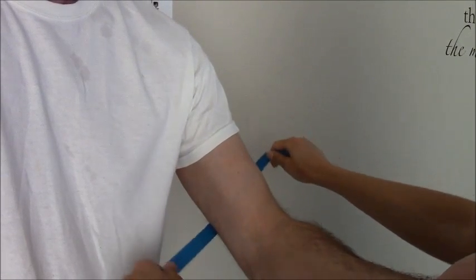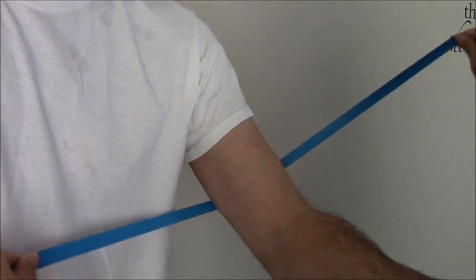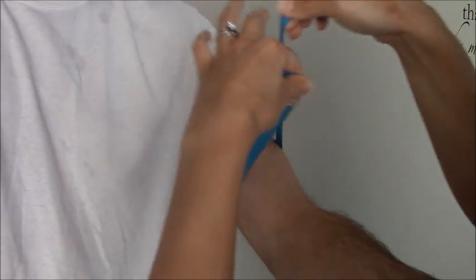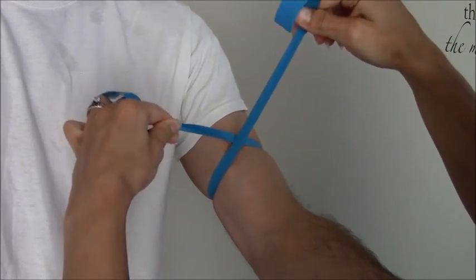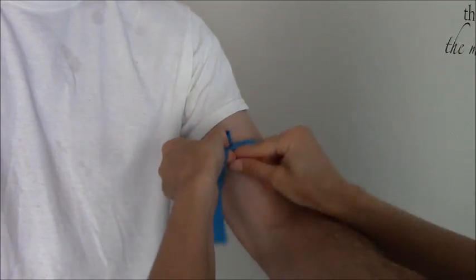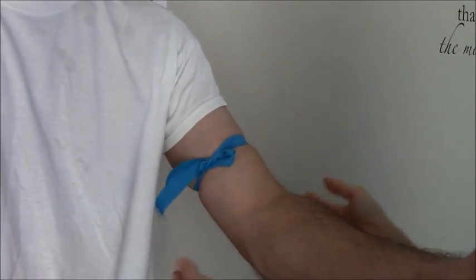First, you're going to explain to the patient what you're going to do. Then take your left hand and your right hand and stretch the tourniquet as far as you can, being comfortable to the patient, to the back of the arm, and cross it like a shoestring. Have it crossed, then take your dominant hand and do a little loop underneath this area and just leave it like so.